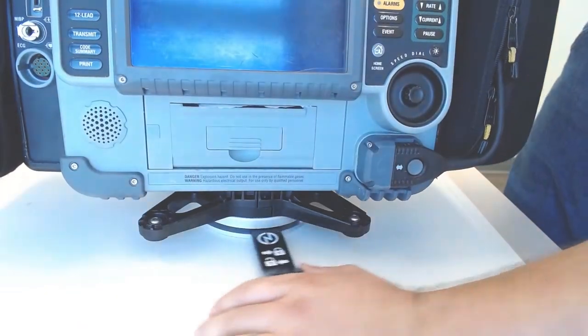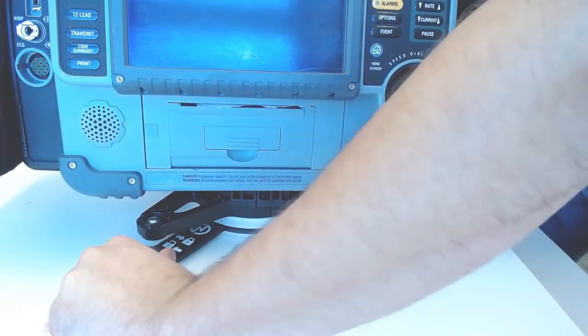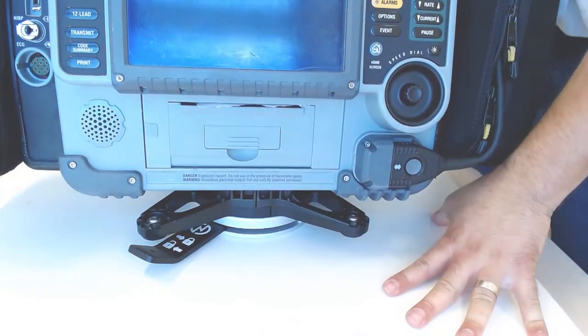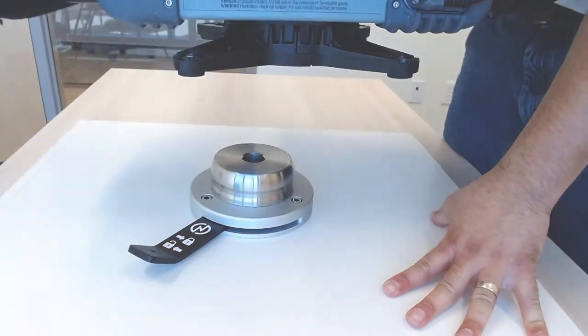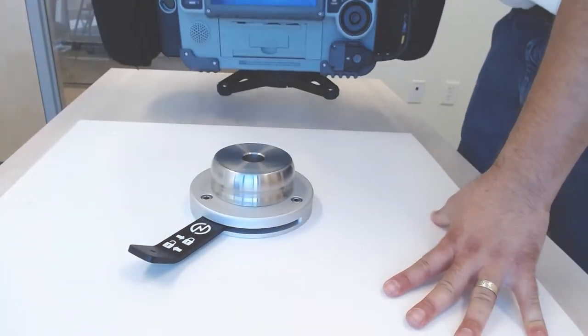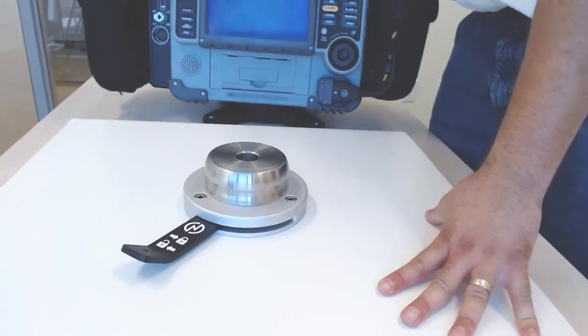Simply rotate to unlock, lift right off, and you're ready.